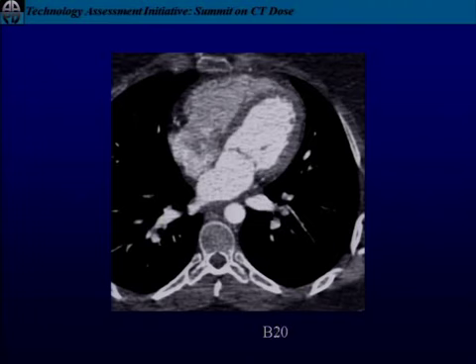We'll go B10, 20, 25, it's getting sharper. Wait, 26 just got smoother again. This is that edge-preserving noise reduction filter. It really did get rid of the noise, but the sharpness is still where it needed to be. Then we'll go up to 30. 31 changes the noise texture.